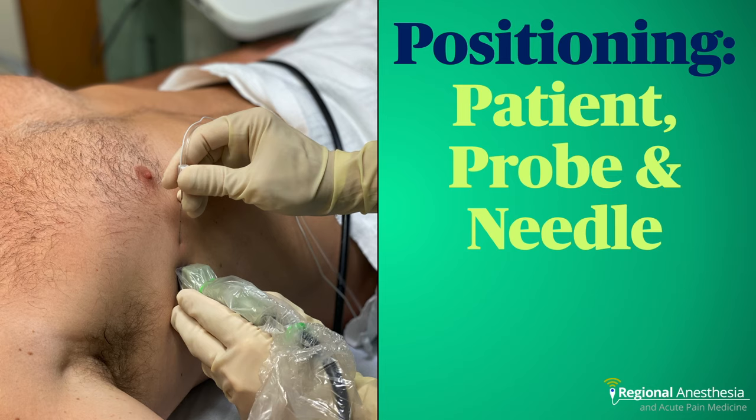We typically block these patients when they're supine while still under general anesthesia — this position is easy, convenient, and ergonomic. The arm needs to be abducted to 90 degrees to facilitate the probe position on the mid-axillary line at the level of the nipple. These are very easy landmarks, which is one of the advantages of this block. A needle is then guided in-plane from the anterior aspect.